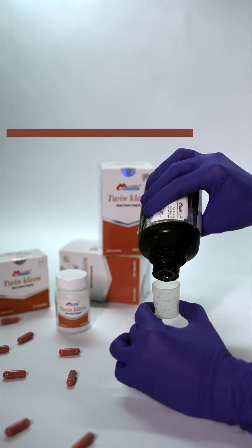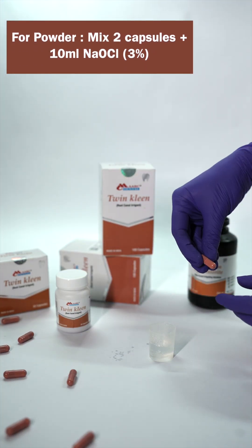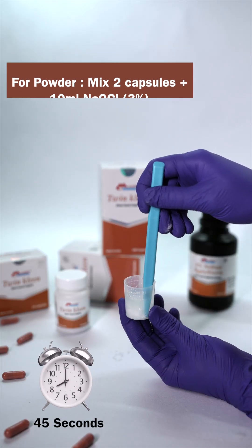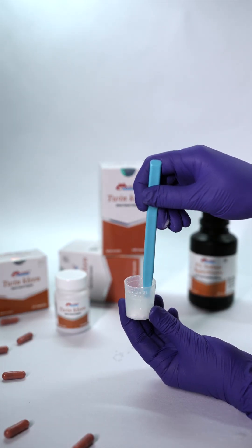For powder, mix two capsules in 10 millilitres of 3% sodium hypochlorite. Stir for 45 seconds and let it rest for 30 seconds.